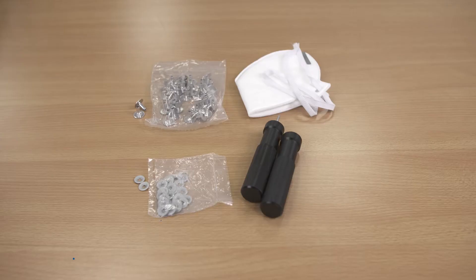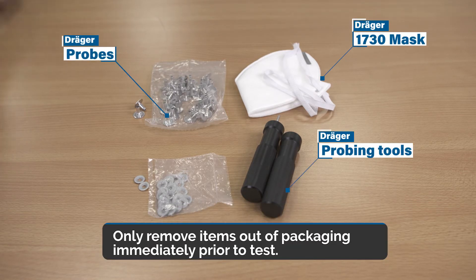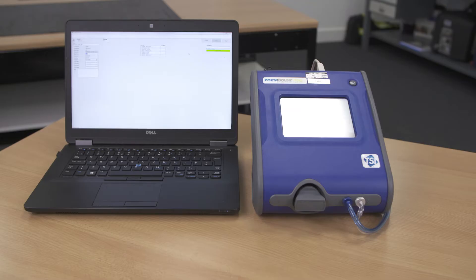Equipment required is a Draeger Explore 1730 mask, the probing tools, the probes to fit inside the mask, your port account and your laptop with current software.